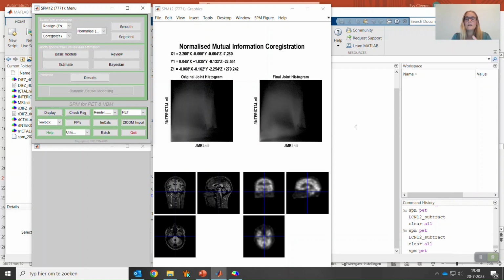So we analyze only one SPECT a week. So I think doing it manually might be equally fast. If you plan to do it research-wise, it might save you a lot of time to have it automated and to make it into a loop. But then be aware that you do a decent quality check of all the images.